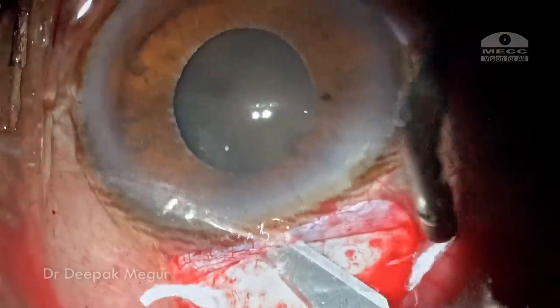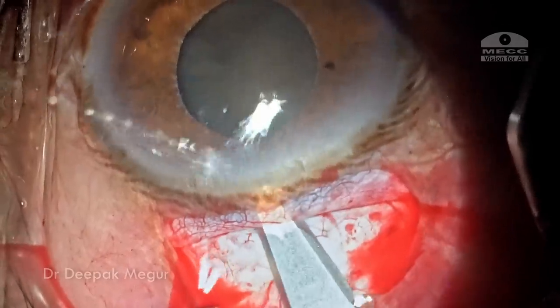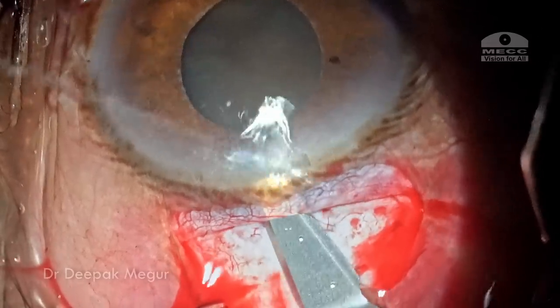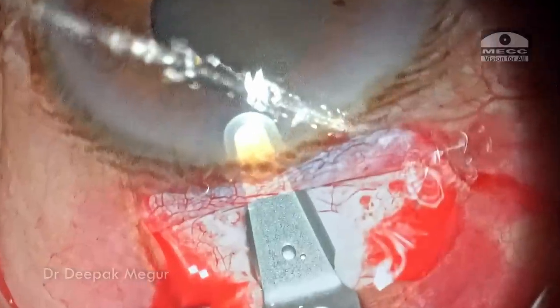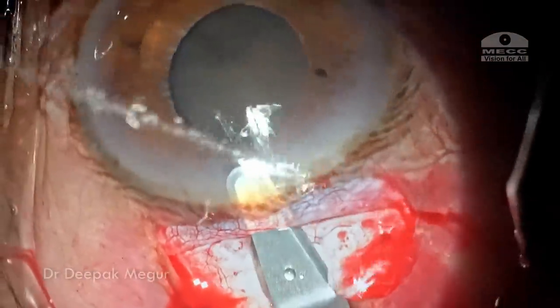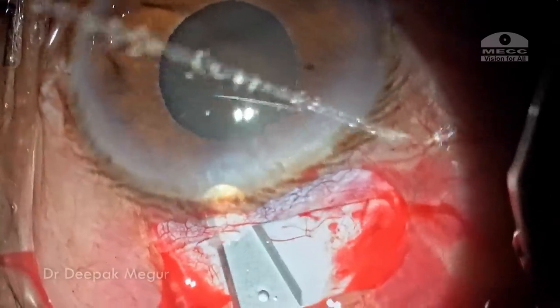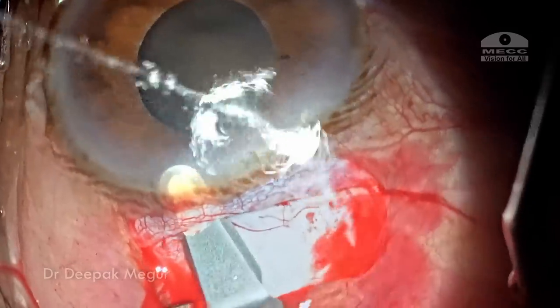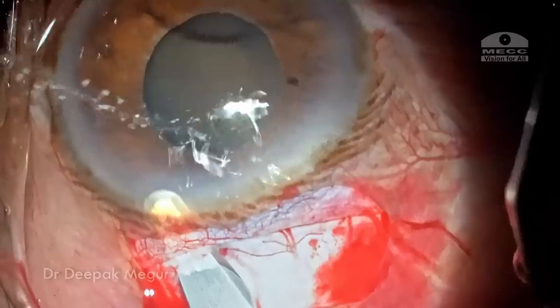A crescent blade is used to create the sclerocorneal tunnel. I typically begin from the center and then go on either side. The external groove is about 1 mm behind the limbus and the intracorneal length is about 1.5 mm. The appropriate depth is determined by looking at the blade — the blade has to be just visible under the sclera, about 0.5 mm depth, and this is the plane in which the sclerocorneal tunnel is being made.